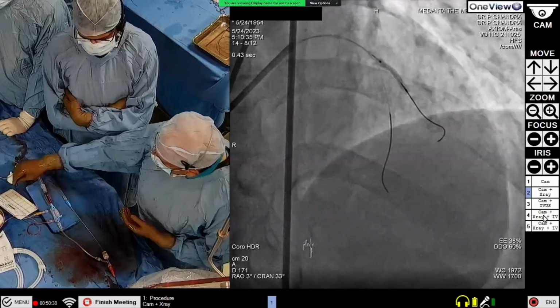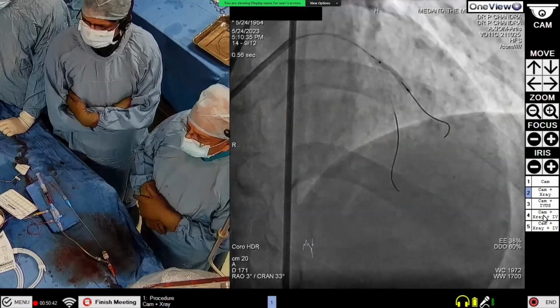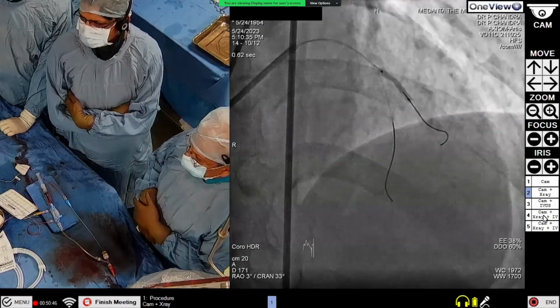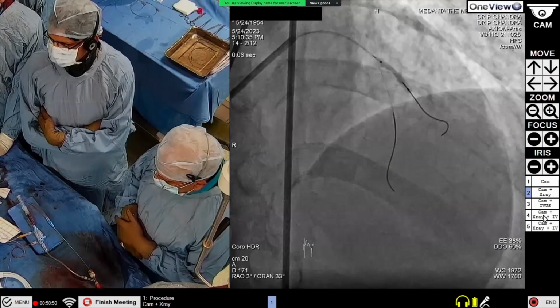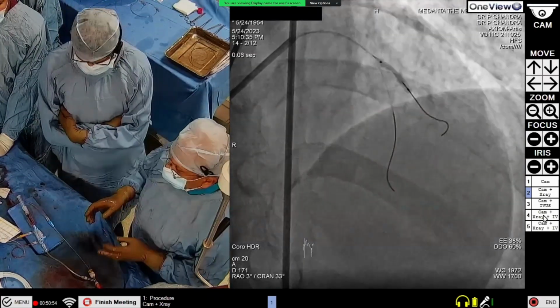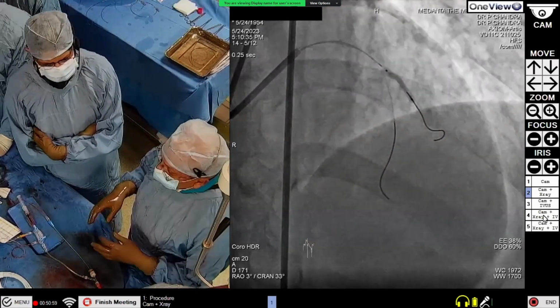It is increasing our confidence day by day that more patients are going home without a stent and they are not coming again for any kind of complications. So this gives a lot of confidence, and once you do it yourself, then only you develop this confidence. Yeah, this all started because many patients were actually waiting for some kind of urgent surgery.